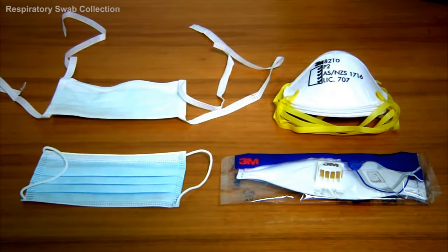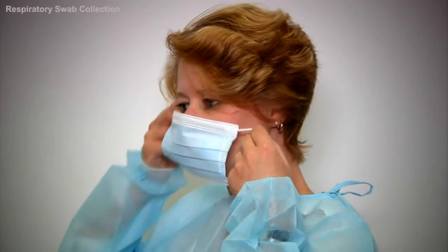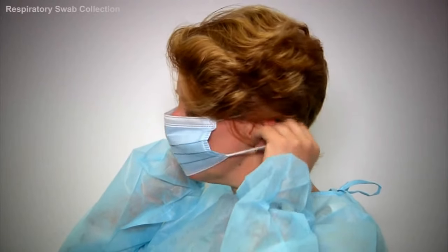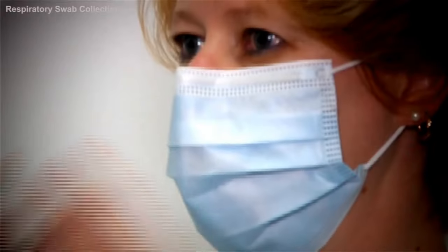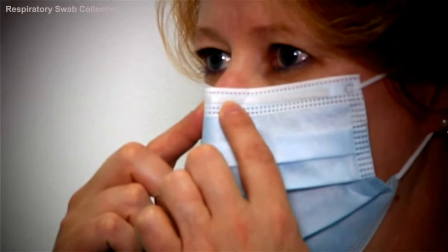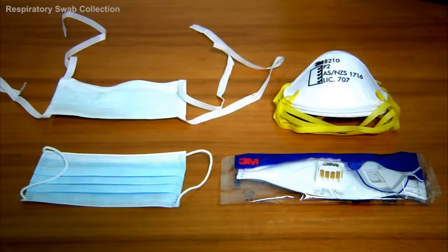Next, select the appropriate mask according to the relevant guidelines. Place an elastic loop over each ear, then open up the mask so it covers the chin and goes over the nose. Using both pointer fingers, mould the bridge over the nose. If you're using a face mask with ties, secure the mask by tying the strings at the back of the head and the nape of the neck.